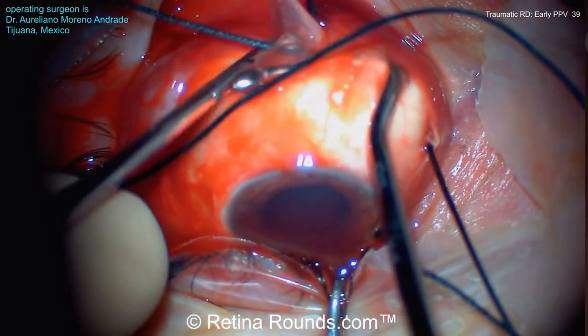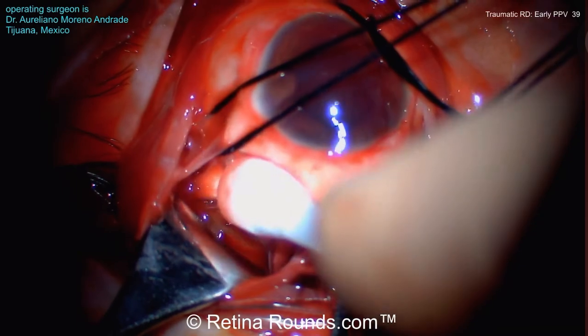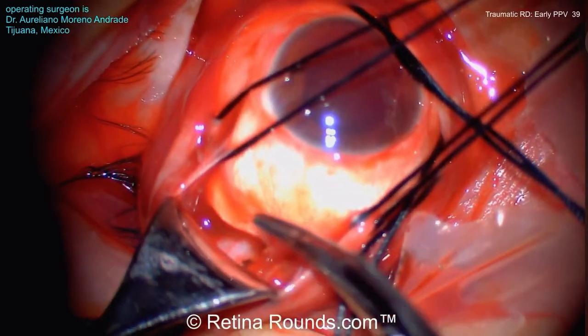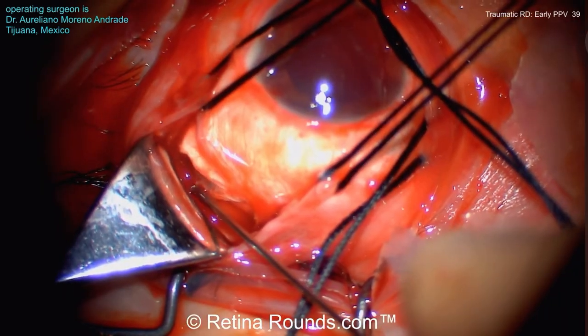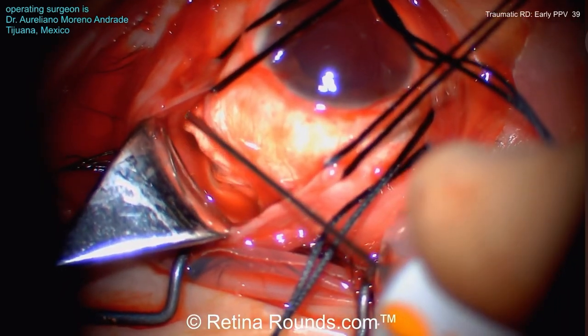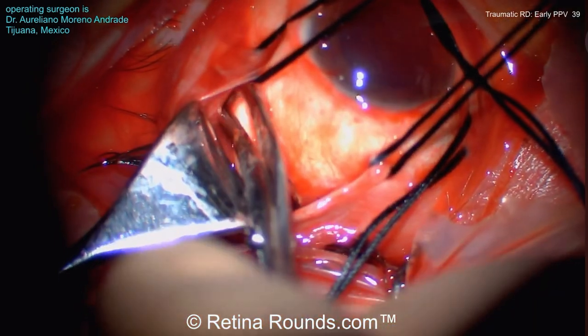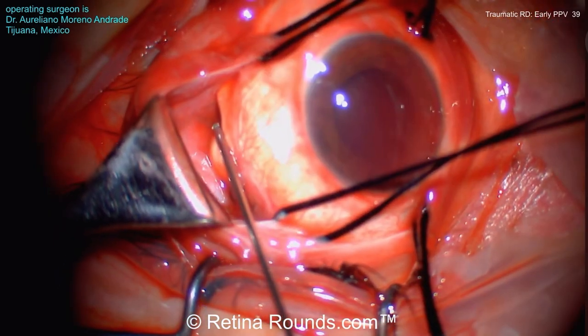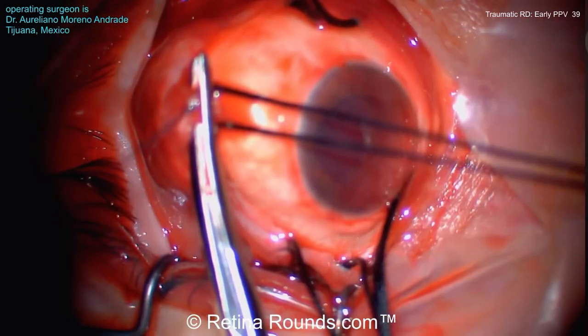Now, Dr. Andrade is performing a 360-degree conjunctival peritomy to perform a globe exploration. He's looped each of the rectus muscles, and you can see that there's an open globe site just posterior to the rectus muscles. This looks to be a ruptured globe. And you can see here any prolapsed vitreous he's removing using the vitreous cutter. And this is a much preferred technique compared to, for example, performing a Weck-cel vitrectomy.